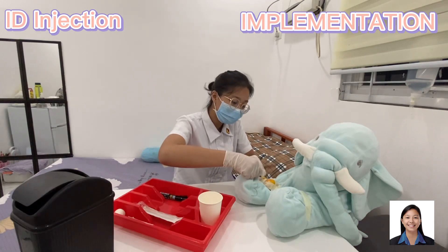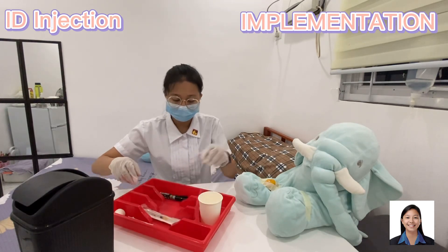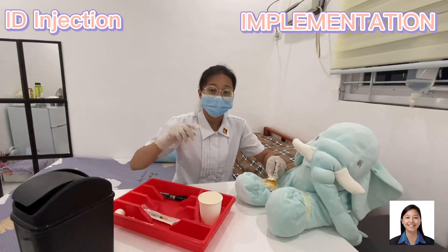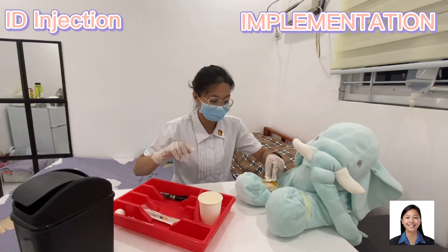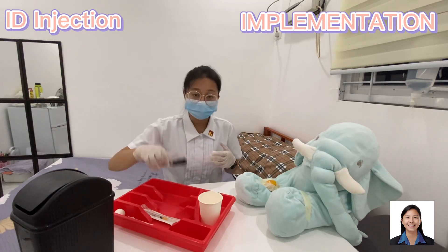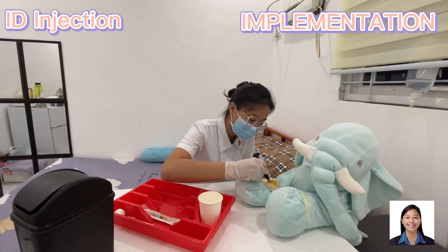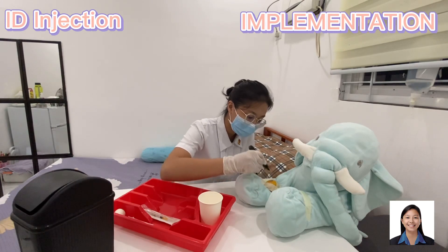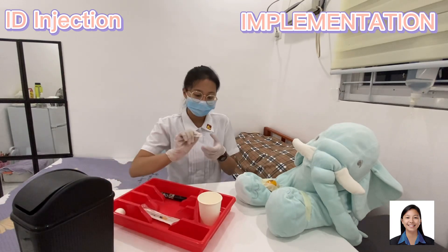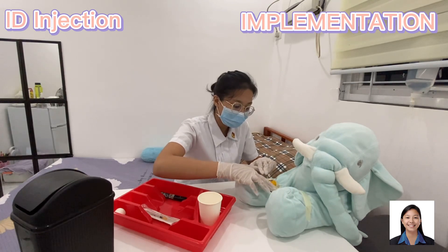After injecting, withdraw the needle quickly. Then blot the site with dry gauze. Remember to not massage the site. Then draw a circle around the perimeter of the bleb.